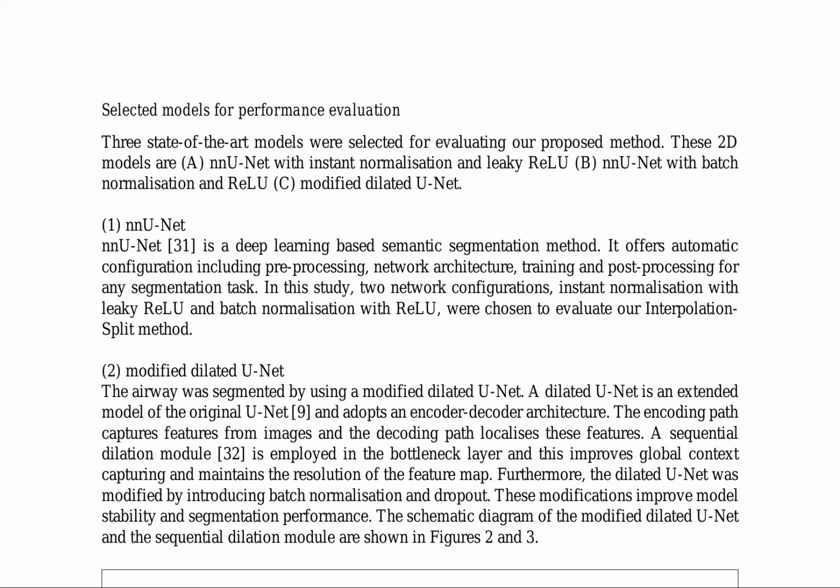The nnU-Net model, a deep learning-based semantic segmentation method, offers automatic configuration for any segmentation task. Two network configurations were chosen to evaluate the interpolation split method: one with instance normalization and leaky ReLU, and another with batch normalization and ReLU.